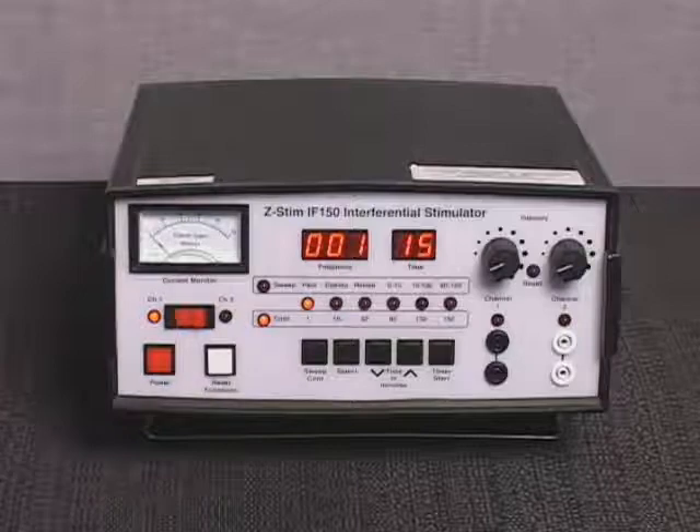If the intensity controls are not in the zero reset position, the generator will emit a sequence of audible signals and the reset intensity's indicator light will flash. Both intensity controls must be returned to the zero reset position, enabling the audible clicks to return to factory default settings.